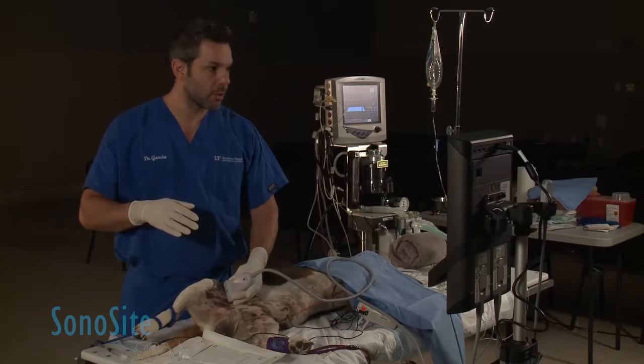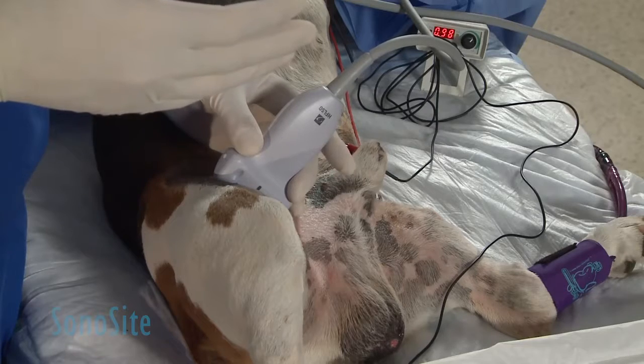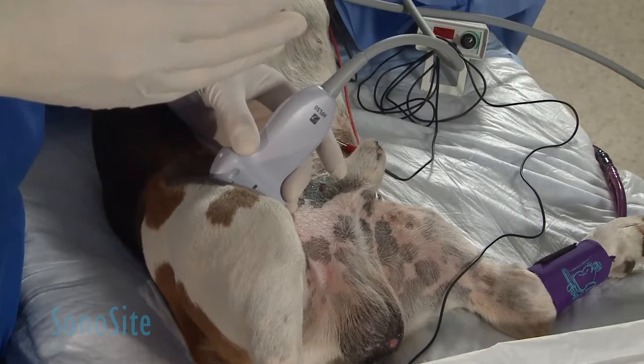What I'm trying to identify is when this femoral artery will give up a branch — the circumflex branch. This circumflex branch is going to help me identify my femoral nerve just medial to that structure.